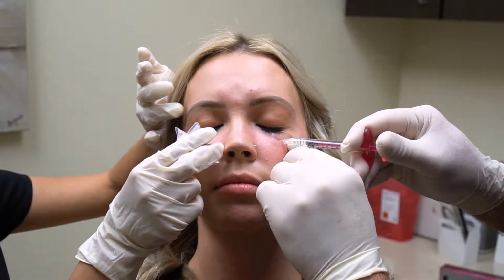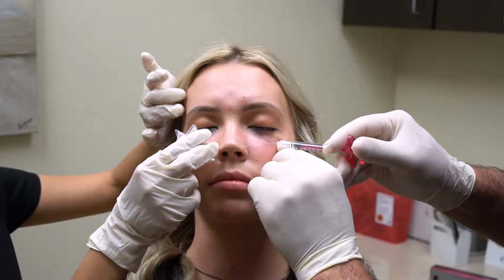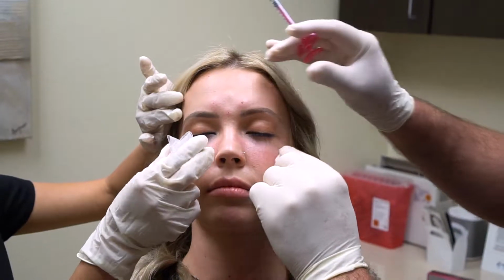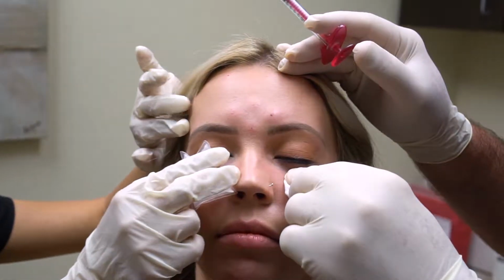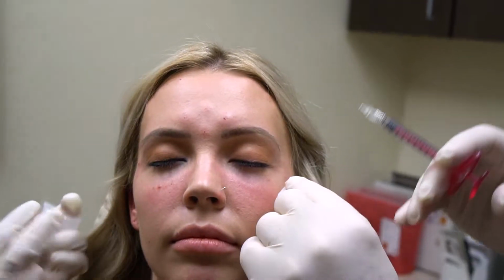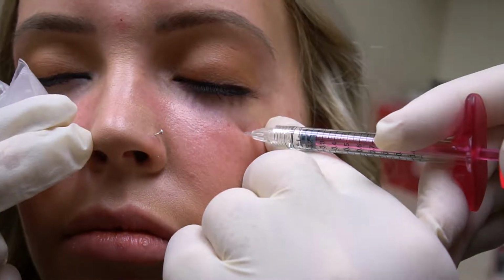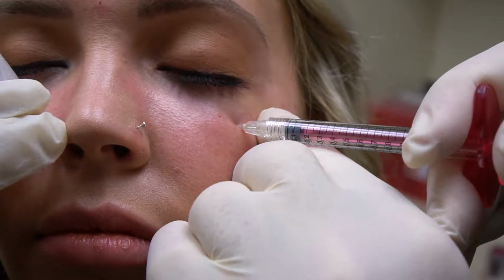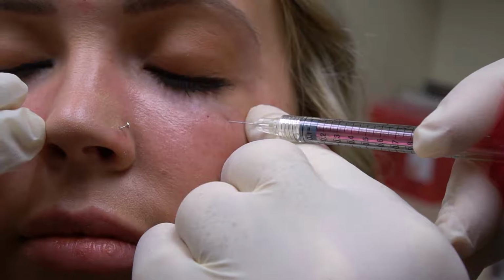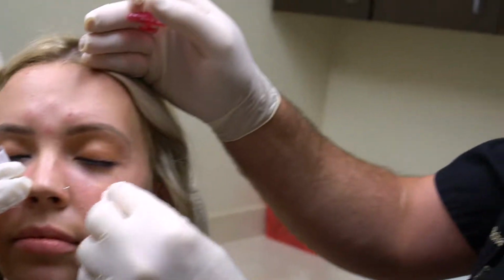Now there are some unnamed vessels in this area, and they do get hit by needles. And it doesn't matter if you take a catheter or cannula versus a needle. You have some people that only use cannulas, and I guess I'll start using a cannula when the manufacturer takes the needle away from me because there's something wrong with it. I think it's more marketing, but I really think that the best way is to be very, very conservative and use small aliquots.